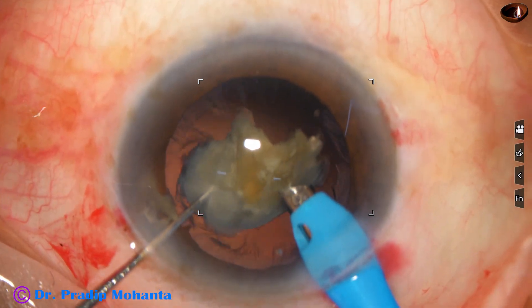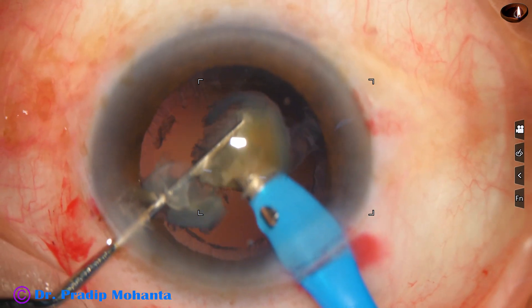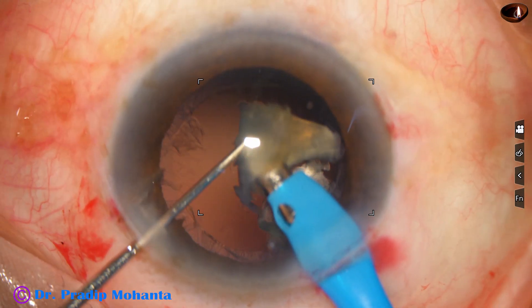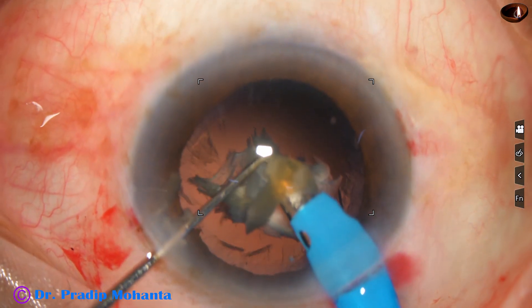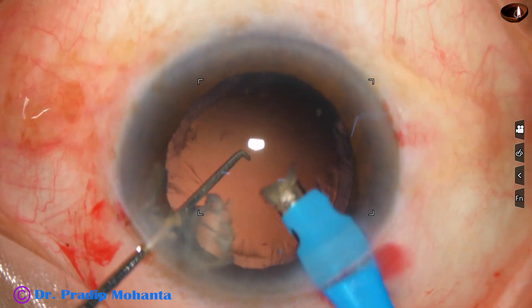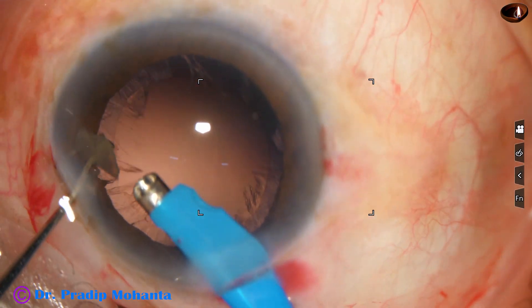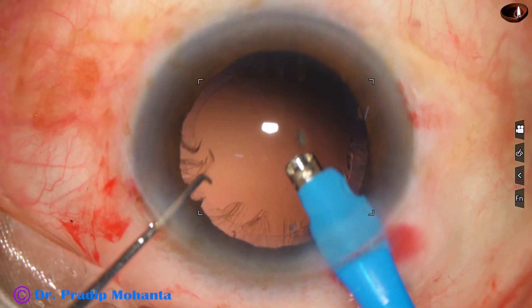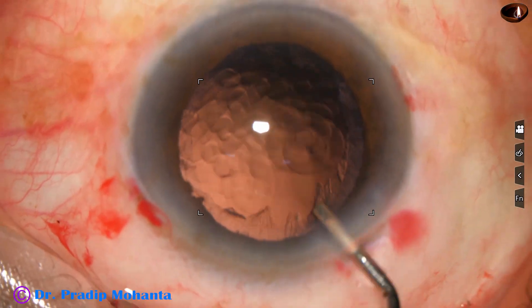Now we are managing the last bit of the nucleus. At this time we have to be extremely slow and reduce the parameters. The vacuum is now 300 and flow rate is 30, whereas earlier the vacuum was 450 and flow rate was 45. The hard nucleus is managed and the epinucleus is remaining. The epinucleus is being emulsified with very low vacuum while keeping an eye on the posterior capsule. This surgery is possible for any keen surgeon.